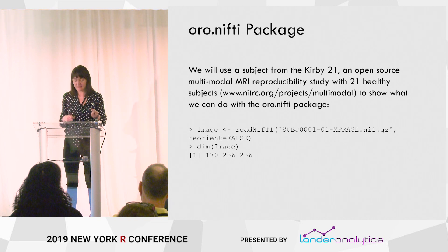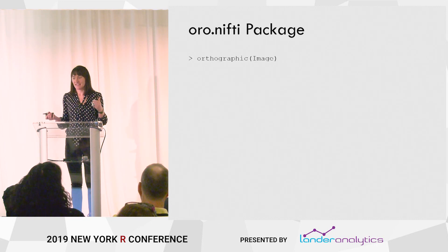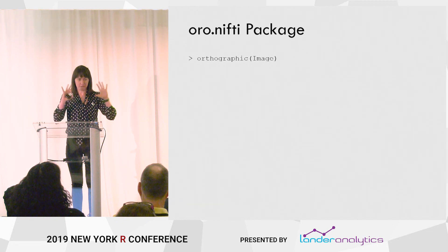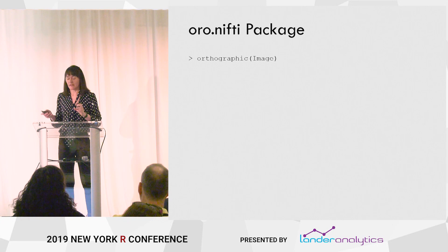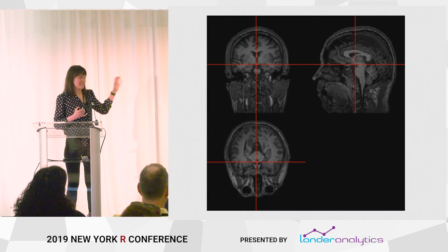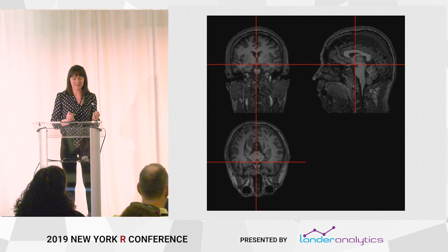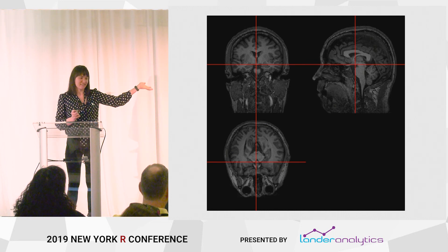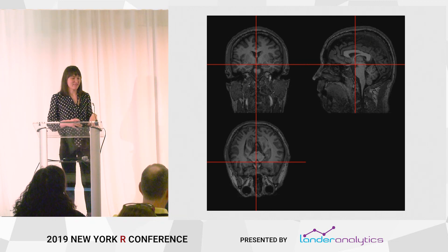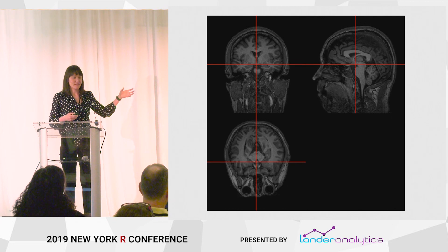If I look at the dimension of that image, it's 170 by 256 by 256 — a three-dimensional array. The main thing I'm always interested in is cool pictures, so I want to visualize this data. oro.nifti has this really nice orthographic function. If I type orthographic image, I get an axial slice, a sagittal, and a coronal slice of the brain — giving us the idea of what's going on three-dimensionally. I can actually publish these; this picture looks good enough for a journal, and it just came out of one function from R.